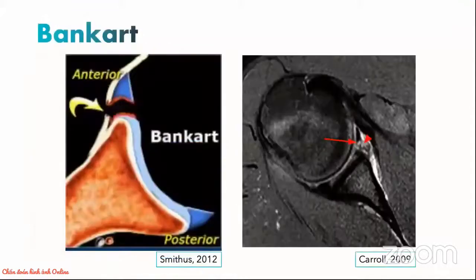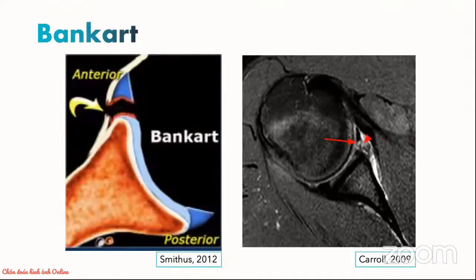The Bankart lesion is the classical labral ligamentous complex injury after an anterior inferior shoulder dislocation. This involves avulsion of the anterior inferior labrum with disruption of its adjacent periosteal sleeve. The axial MRI image on the right demonstrates this very nicely. The arrow points towards the avulsed anterior inferior labrum, while the arrowhead shows the disrupted adjacent attaching periosteal sleeve.